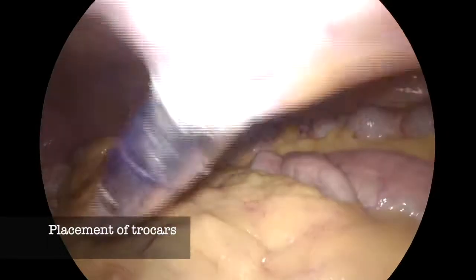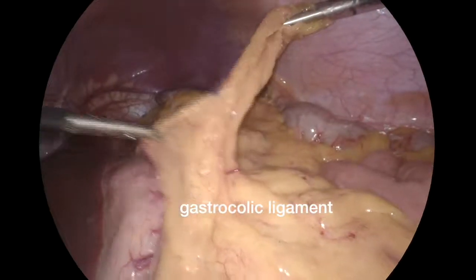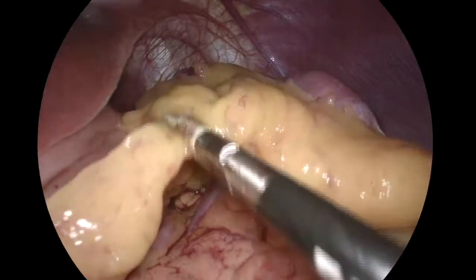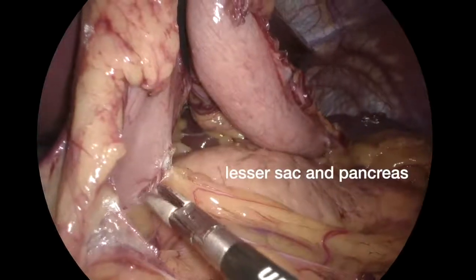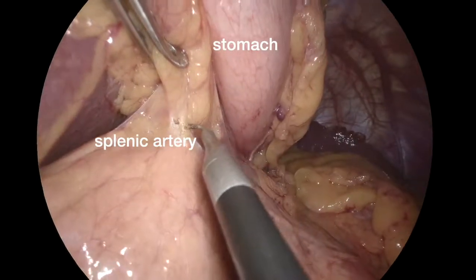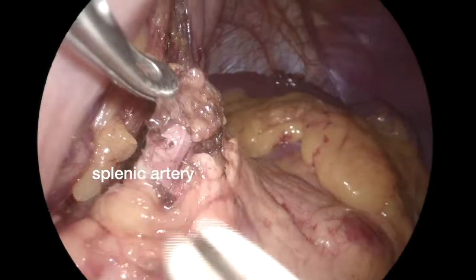After the camera port was inserted and pneumoperitoneum was done, the trocars were put in place as in the previous figure. Gastrocolic ligament was resected. Short gastric vessels were also cauterized. Continue resection until we got good exposure of the lesser sac and pancreatic body. Lifting the stomach up helped us stretch the celiac trunk, then we would control the splenic artery as close to the celiac trunk as possible.